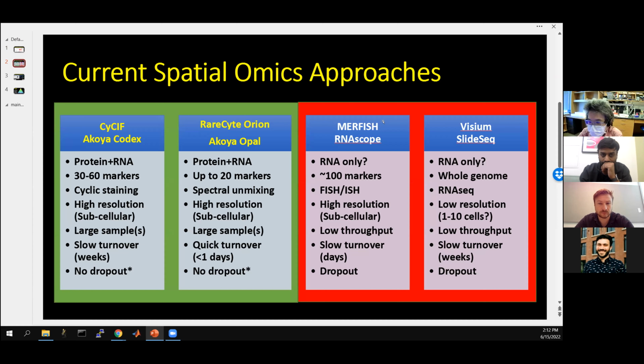As far as we can tell, I will tie back to the image method, CYCIF, or more generally image-based or antibody-based spatial proteomic methods. They have a limitation here because we use antibodies, so the number of markers is limited, unlike some sequence approaches or even in situ approaches, where you can reach a much higher number of detectable biomarkers.